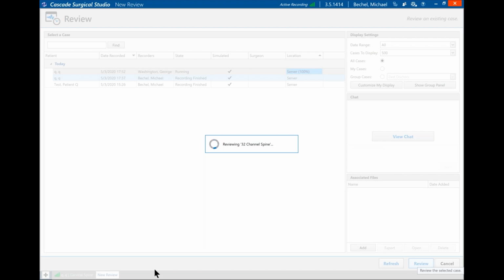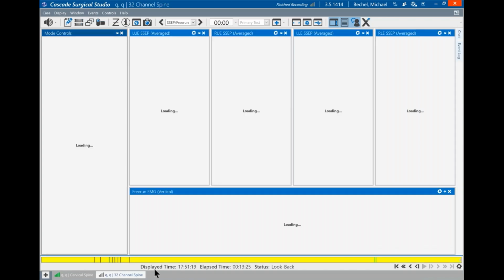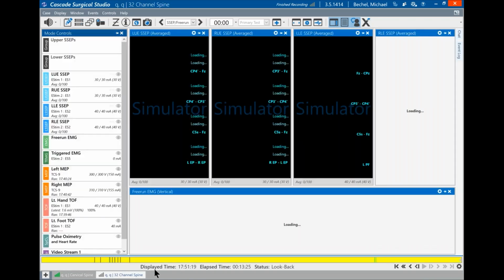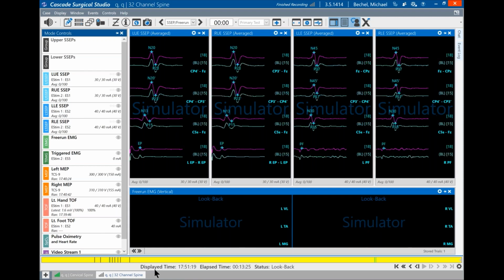Now, what else can it do? Well, it securely encrypts the data communication and storage. So the streaming data is automatically saved to the CadLink server. The data is collected offline and is automatically moved when the client, your system, reconnects to the CadLink network. Everything is HIPAA compliant, and it does audit logging.